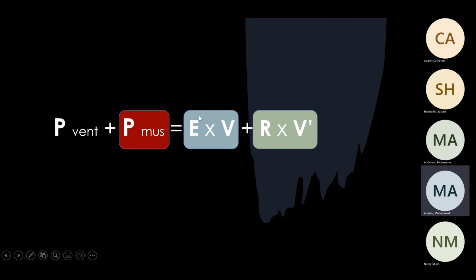However, if I'm the one controlling the volume, then the pressure is not controlled. It is controlled by the patient's mechanics itself. If I'm the one controlling the pressure, then as we mentioned, the patient will control the volume part. And as we know, resistance and flow go together. If I have very narrow airways, that will mean high resistance, and we need higher power and pressure to overcome this resistance and flow. All right, so this is the most important.